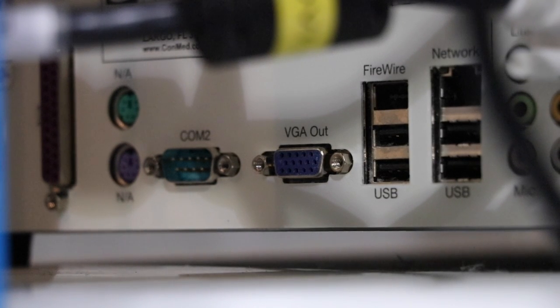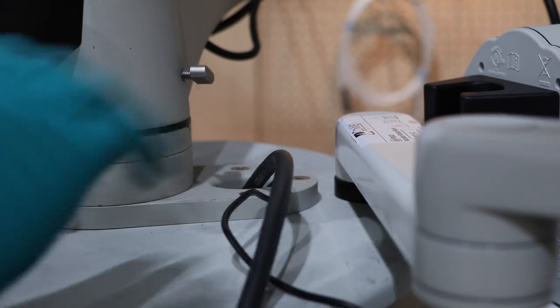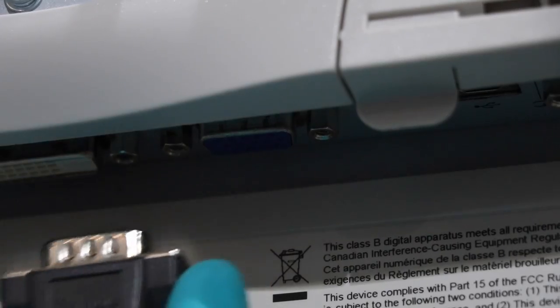We'll plug that into the DVI output on the back of the DRS-HD. From the VGA output on the DRS-HD, we'll plug in our VGA cable and plug that into the back of the DRS-02.